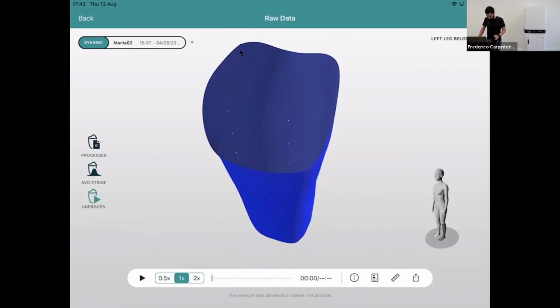And then you have the unprocessed results. This is very similar to what you would be seeing in real time. But this allows you to see it afterwards and think about the information in more detail. This is also very important to show to the actual patient, where you're explaining what might be happening in the socket. So you can just reproduce it.